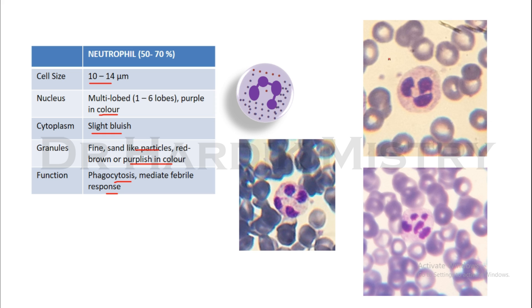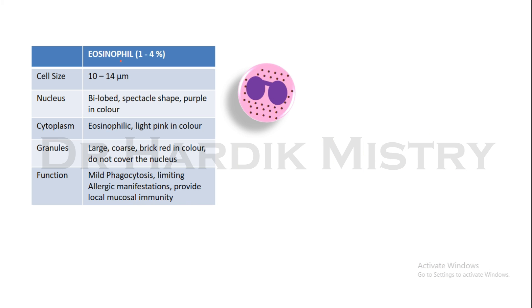These are actual photographs of neutrophils taken in the hematology lab during peripheral blood smear practical. Look at this neutrophil — there are 4 lobes of the nucleus. This one has 3 lobes. And this one has 5 lobes of the nucleus. All these cells are neutrophils and they are granulocytes.